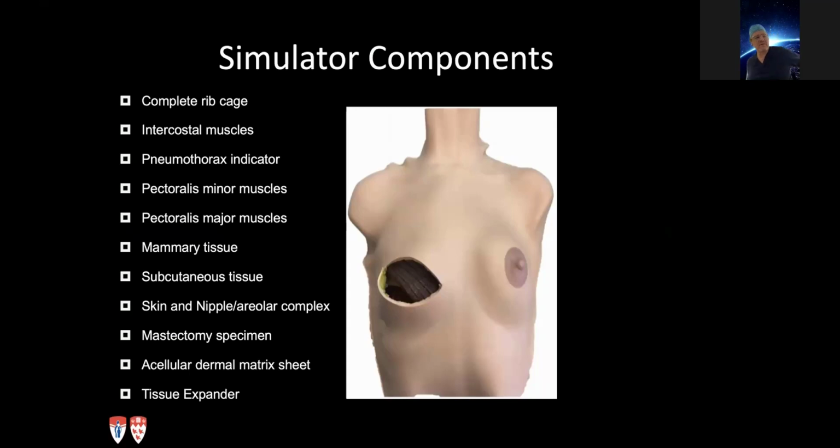And as you've seen here, this is one of our simulators, which we created a couple of years ago, I think in 2014, 2015 or so. This is a simulator which surgeons can use to train themselves on breast reconstruction. When you do a mastectomy, you take part of the breast away and you want to reconstruct that breast, you want to have a simulator which is as close to a real breast as you can.